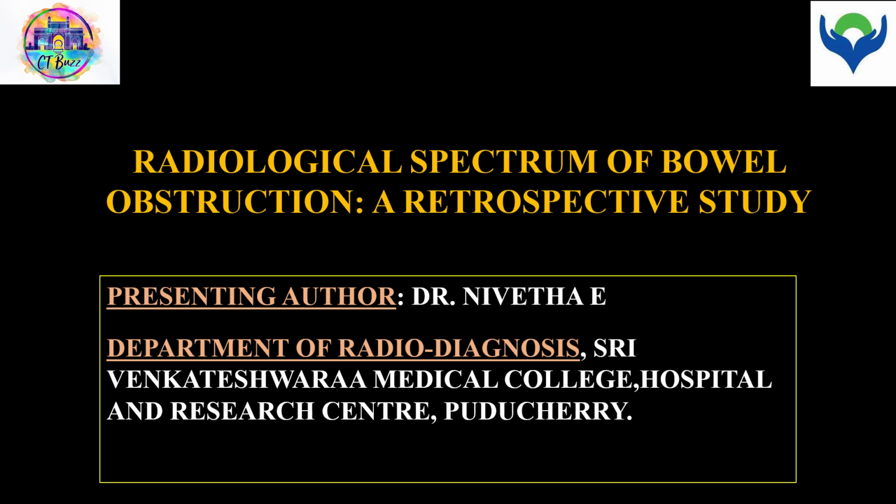Today, I will be presenting a retrospective study titled Radiological Spectrum of Bowel Obstruction. This is a CT-focused emergency department series, and in this presentation, I will walk you through the background, aims, methodology, and selected cases with imaging before concluding with the important learning points.